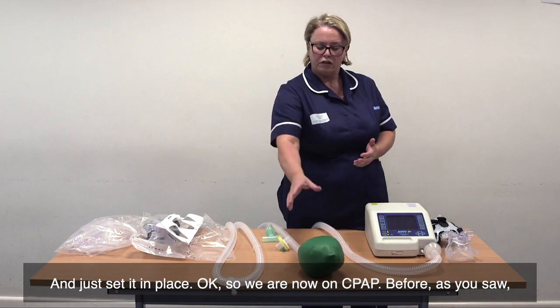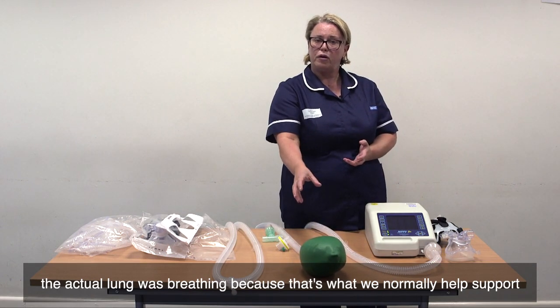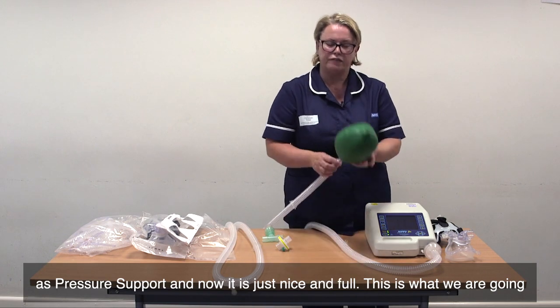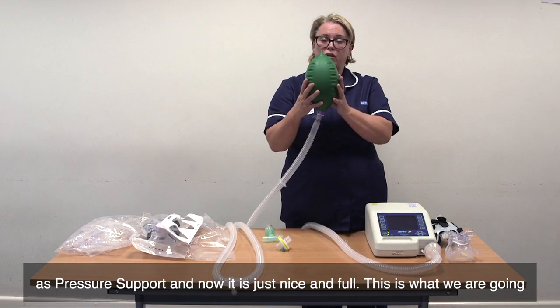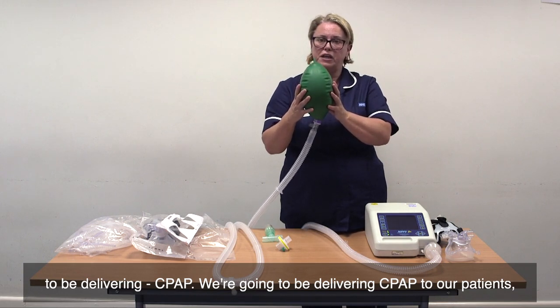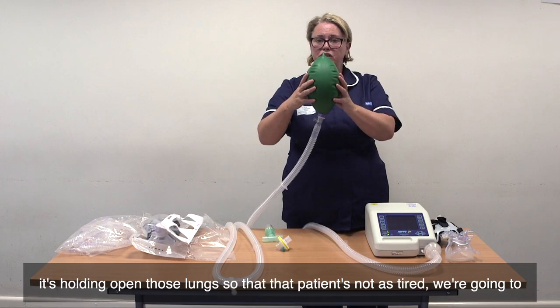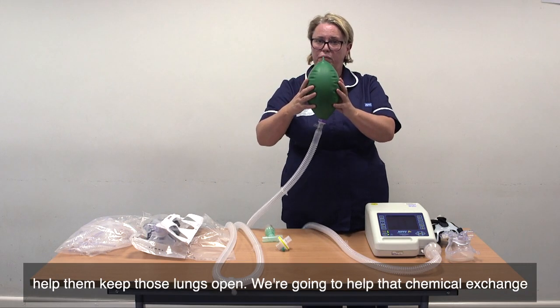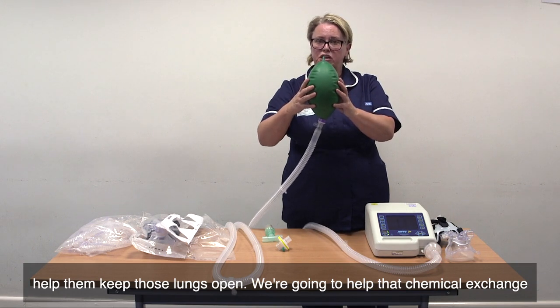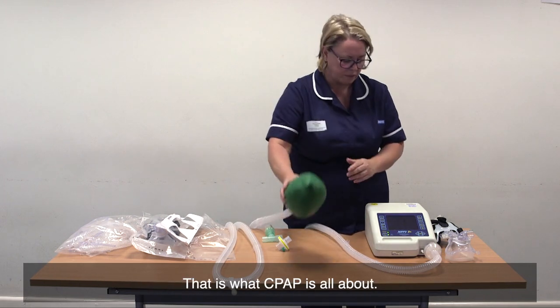Before, as you saw, the actual lung was breathing — that's what we normally help support with pressure support. And now it is just nice and full. This is what we are going to be delivering with CPAP. It's holding open those lungs so that the patient's not as tired. We're going to help them keep those lungs open, help that chemical exchange work, and help to bring those saturations up. That is what CPAP is all about.